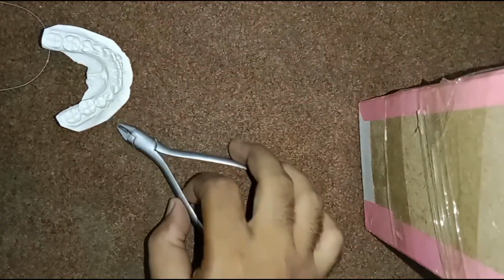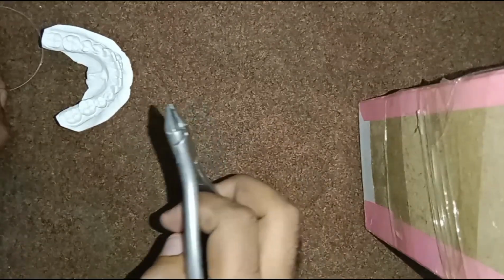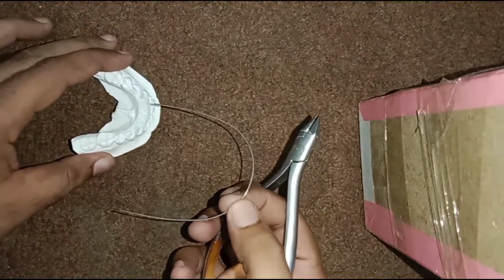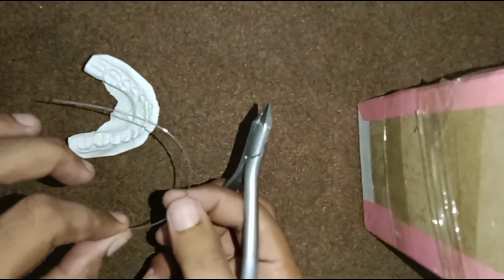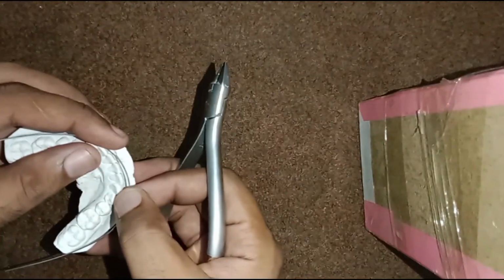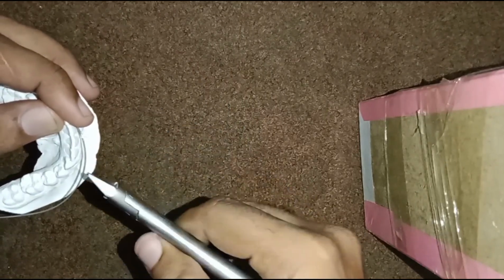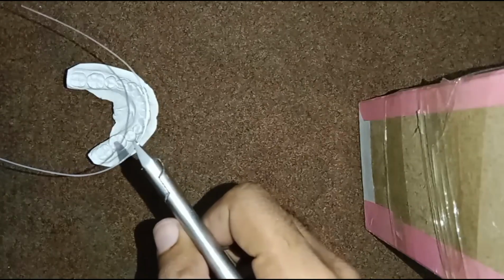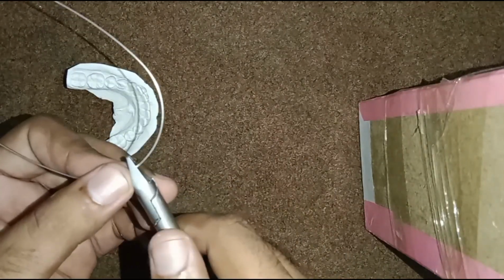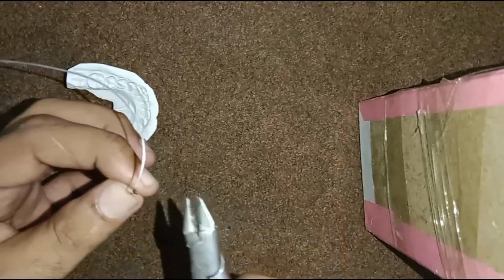For making the intrusion arch, we will use this plier. This is a bird beak plier. 16x22 SS wire will be used. This is a model for demonstration. We will place the wire on the model, mark the wire distal to the lateral incisor, then hold the wire at that mark. We will give the wire a bend of 90 degrees. This is a downward bend.